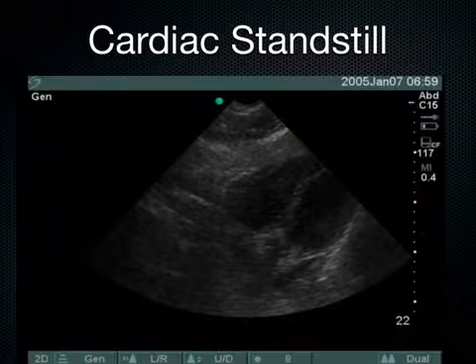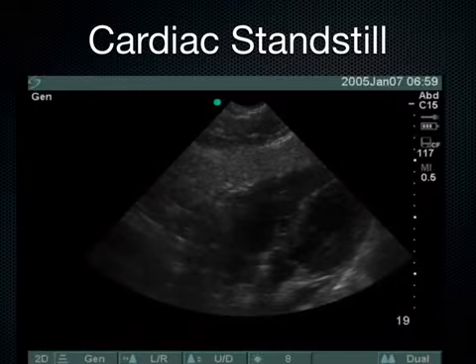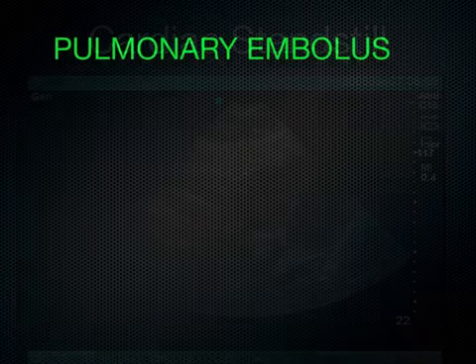And then, after we flogged a patient for a few rounds of ACLS, if we see the heart is standing there, it sort of makes everybody feel better about stopping the code, and the family as well can be brought in, show them what a cardiac standstill looks like. That's something else to consider.